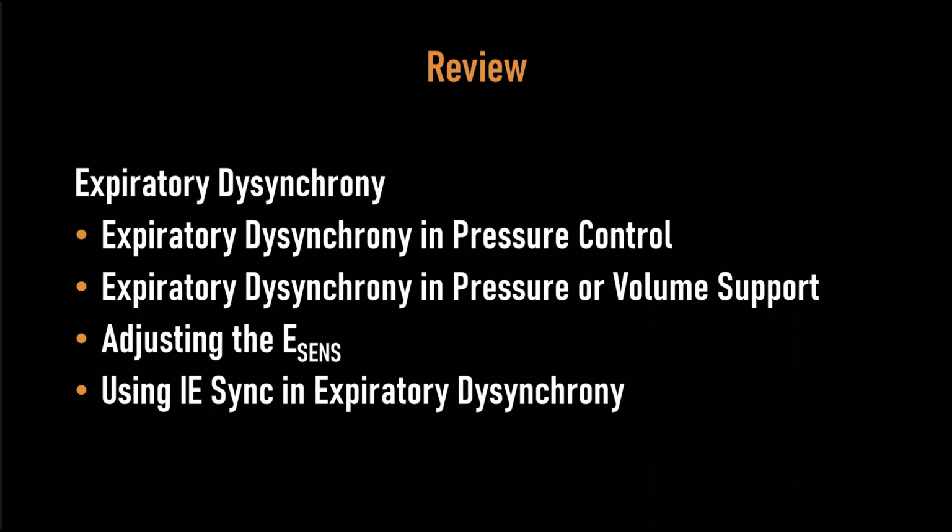The newest adaptation to modern ventilators is to add an intelligent concept to it using computer algorithms and flow and pressure sensors, and this is known as IE Sync. And it's used to map out what's going on with the patient both in inspiration and expiration. And I explained to you how you can use IE Sync to treat expiratory dysynchrony. It doesn't always work, and it doesn't always work well, but at least it seems to make the patients a lot more comfortable.